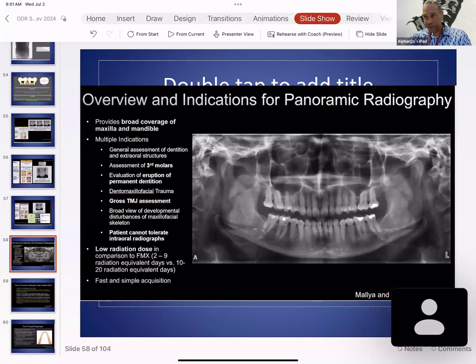You also can see the airways, the radiolucent areas of the airways. You see the spinal column, and you see so many things here. So again, you have to look at a lot of these images and keep looking at them so you can really appreciate what's normal and what's abnormal.